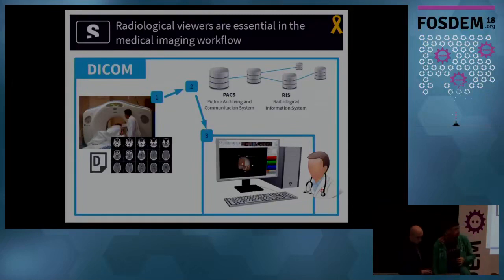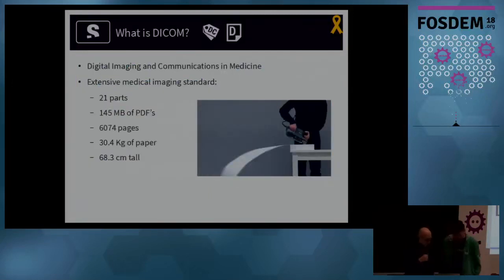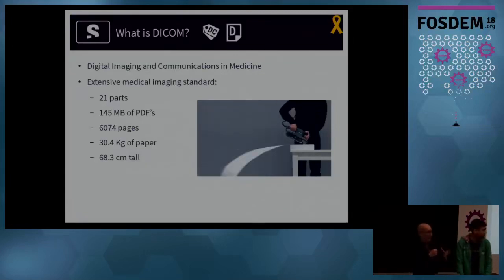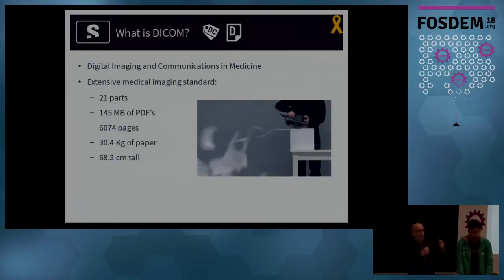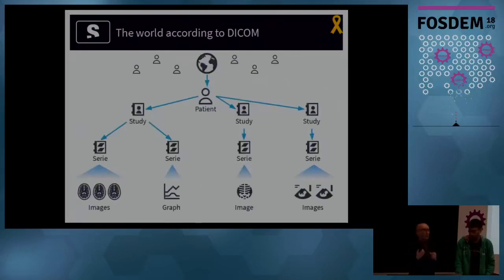All this is governed by a standard called DICOM. It's a very thick standard which governs how medical images shall be stored, retrieved, saved, communicated, etc. And it's very extensive. And this standard gives also the vision of the world, which is the following.